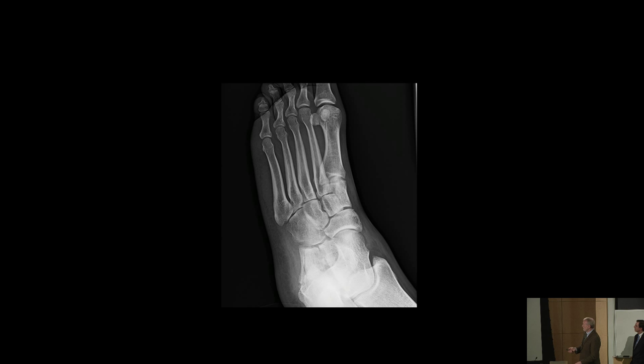You can see, however, that there's comminution extending into the anterior process, so there probably is more that you can't see. The medial wall is buckled. It's about a centimeter lateralized. That puts it on the border of whether it needs an operative approach or could be managed non-operatively.